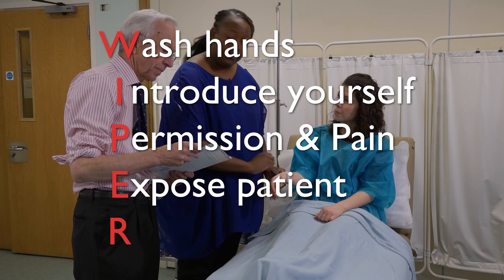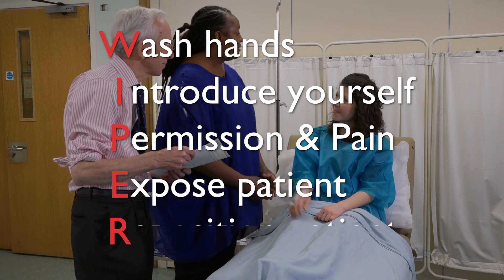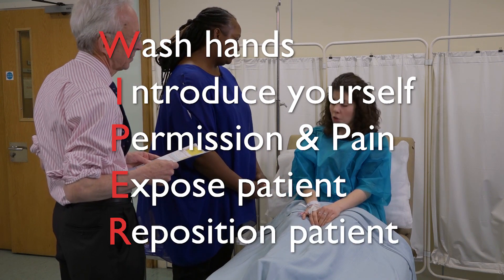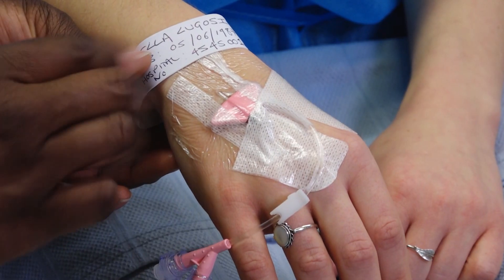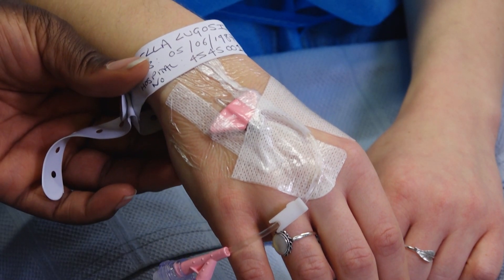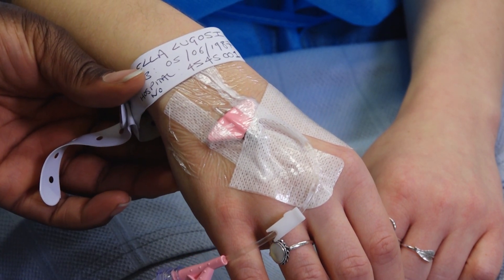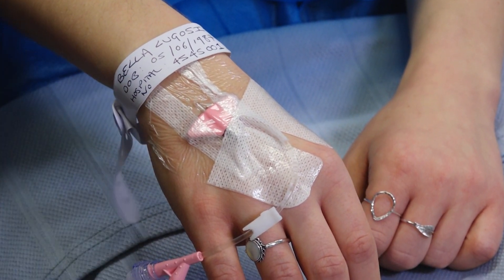Expose their arm and cannula and reposition as appropriate. Observe the cannula site for any signs of inflammation or misplacement.